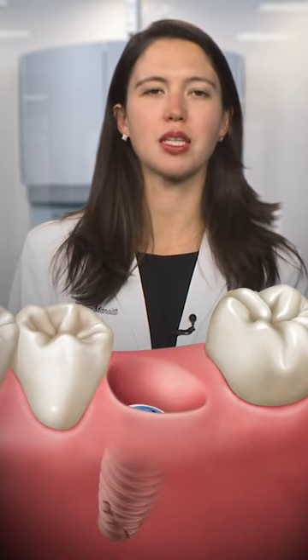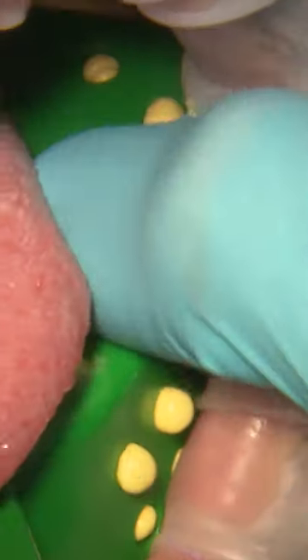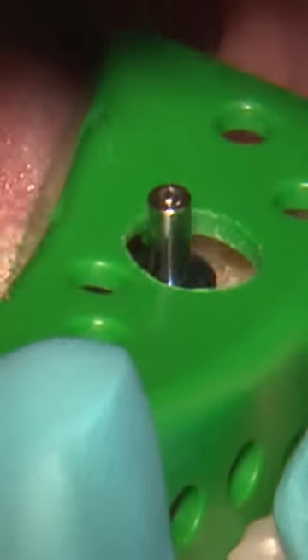Today I will show you a case where we are going to restore an implant that was previously placed at site number 19. Impressions may be taken with either the indirect closed tray or direct open tray technique, depending on the clinician's preference and chairside conditions.